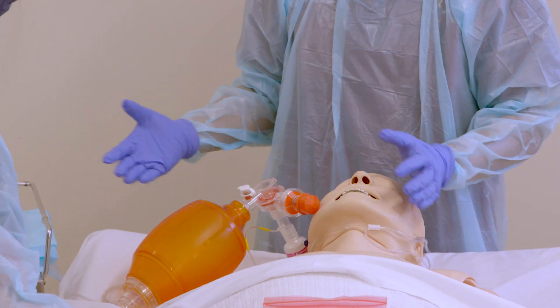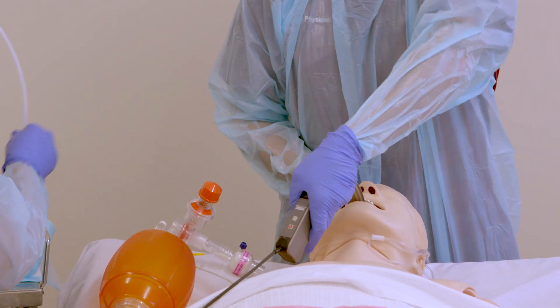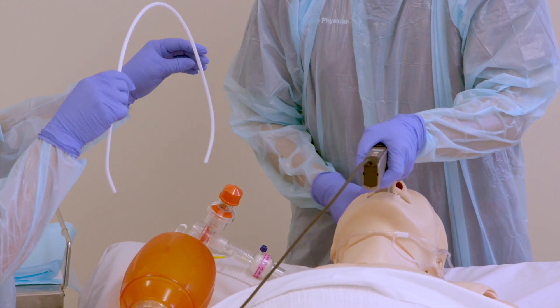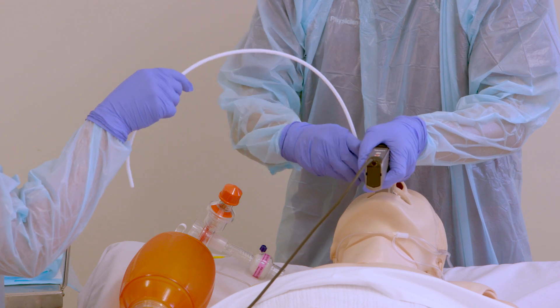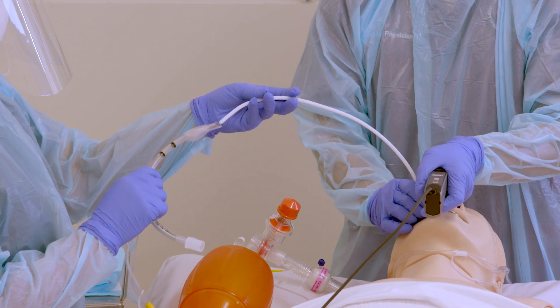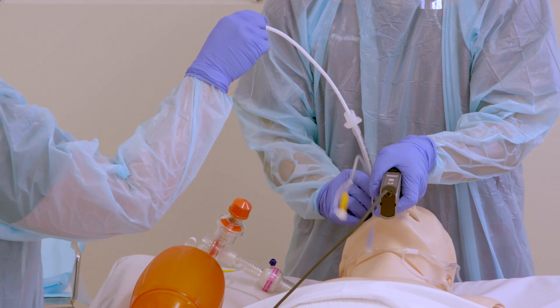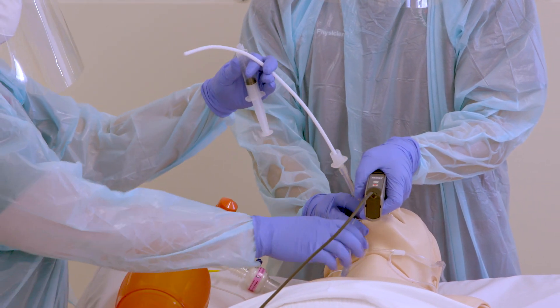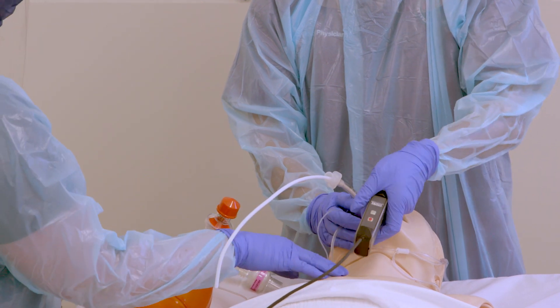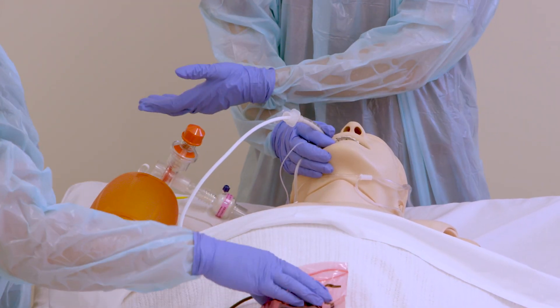Insert the C-Mac blade until a good view is obtained. The bougie is frequently used to railroad the ET tube. Inflate the ET cuff. Place the C-Mac into a seal bag. Pass the clamp to the airway doctor.